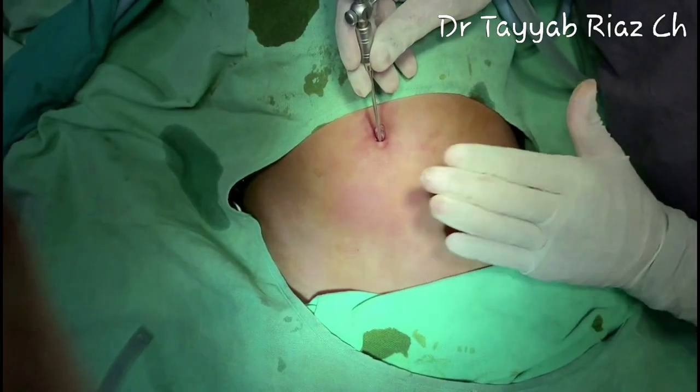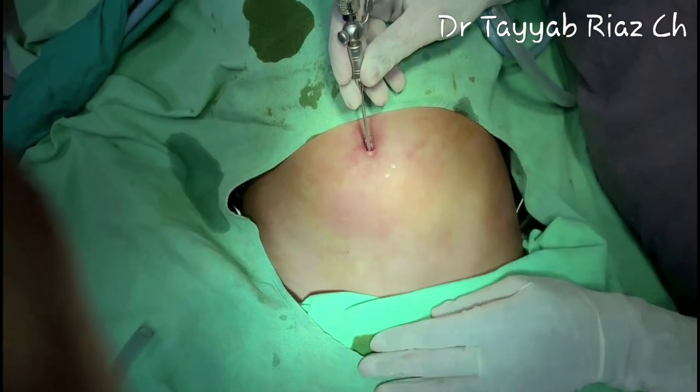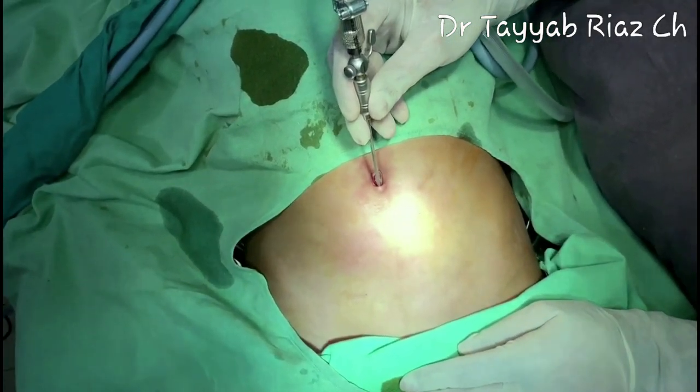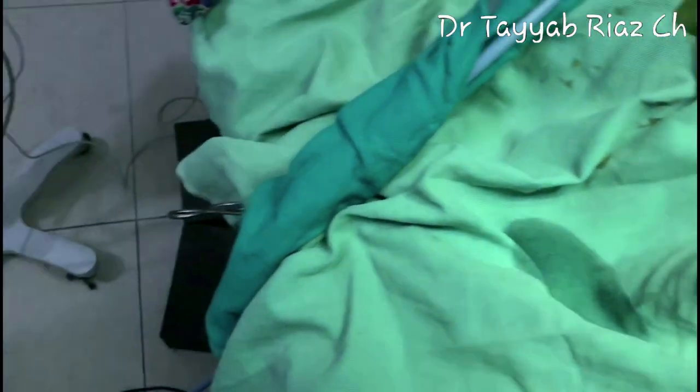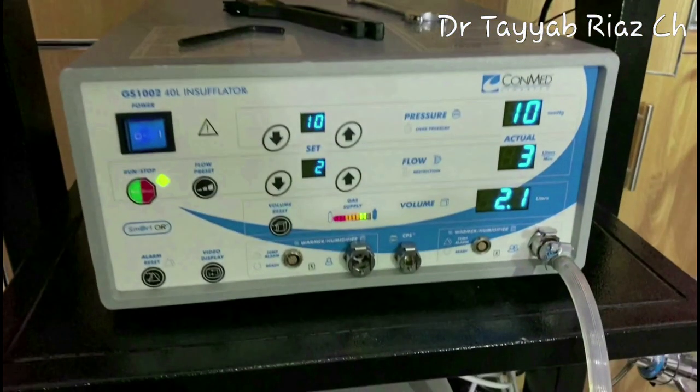I am tapping the abdomen for resonance to check the insufflation, and after some time the actual pressure has reached my desired pressure. If you look at these indicators, actual pressure is equal to the preset pressure and the total amount of gas is 2.1 liters. On Veress needle, the total amount of gas should be between 2.5 to 6 liters, and it depends upon the age, physique and build of the patient.